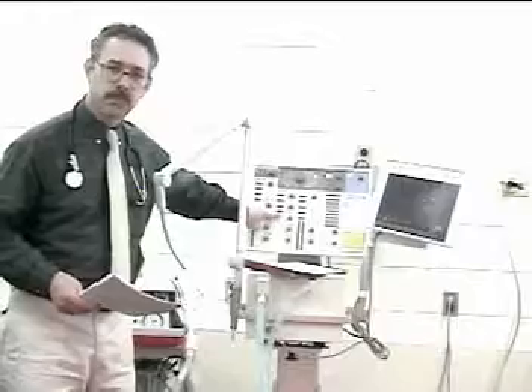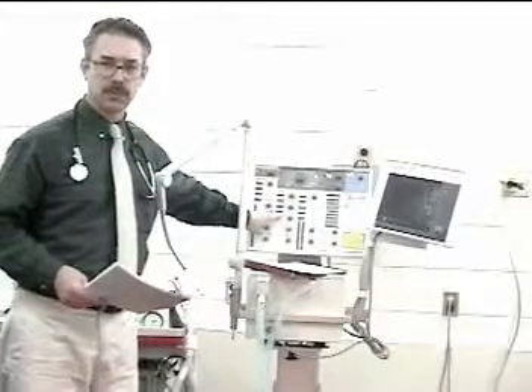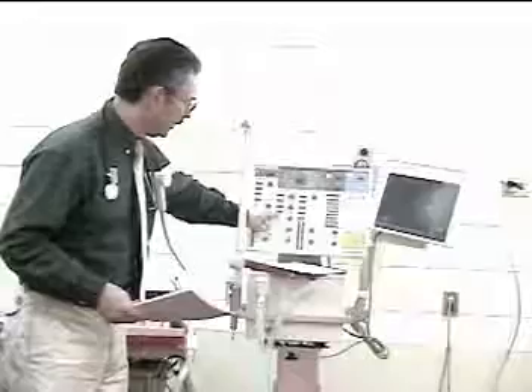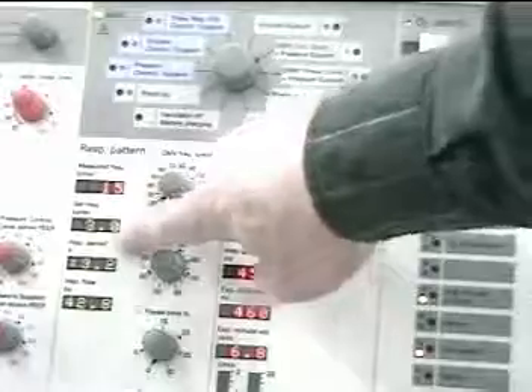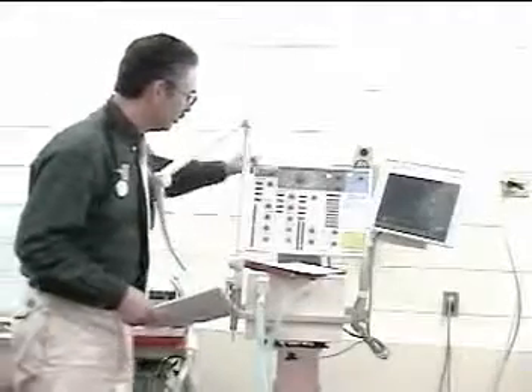For flow rate: the ventilator displays inspiratory flow rate in liters per second. To convert to liters per minute, press standby and then the mode button, and it automatically switches to liters per minute — in this case 42.8 liters per minute. You also get the I:E ratio and the inspiratory time in seconds. Press standby again to exit that mode.